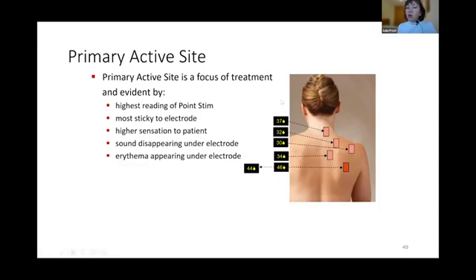So what I'm doing now, I'm analyzing where my gates are open, where the best entry for my influence is. I look at all these numbers and I see, okay, 46, most interesting. Somehow this point is linked to whatever injury is inside. So what I'm going to do, I'm just going to use dynamic treatment. But this is just to make a point.